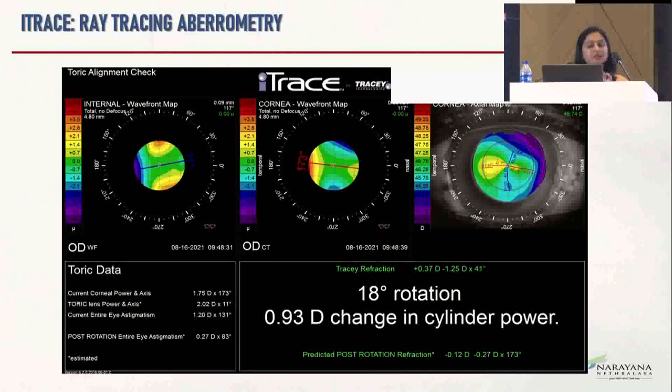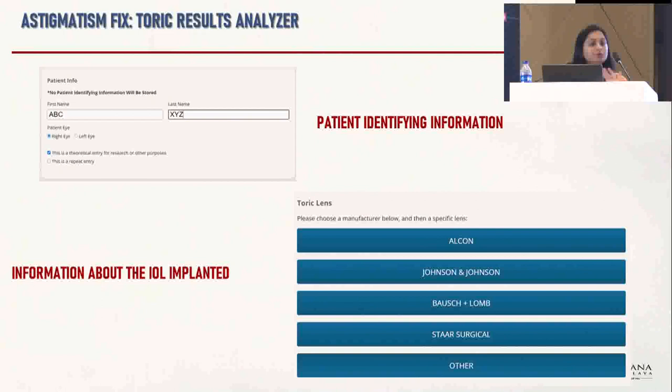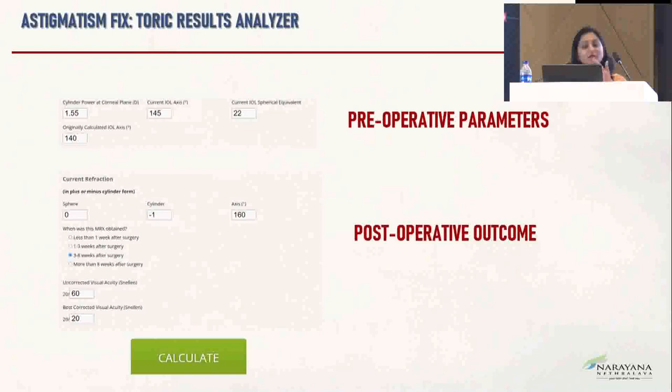Another important thing that is available online is astigmatismfix.com. This is a tool where you can analyze your residual astigmatism post-operatively and how to correct it. Once you put in all the patient data and information about the IOL that you have implanted, it will tell you the pre-op parameters, and you need to put the post-op outcomes also.